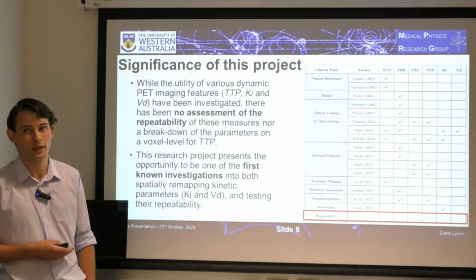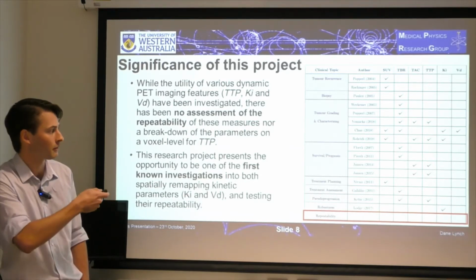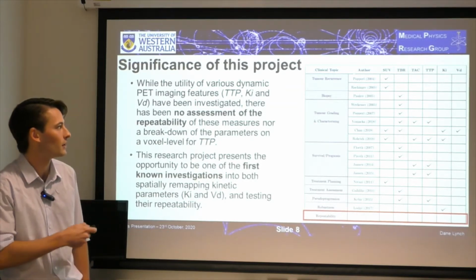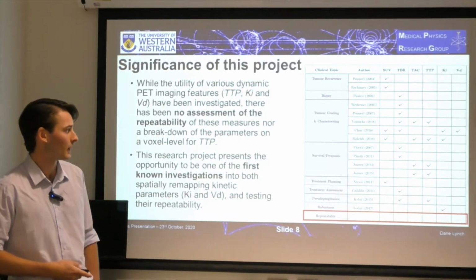and in testing their repeatability, filling this gap as shown by this literature review table on the right, where up here we have the types of PET imaging features and the clinical area for which they've been shown to be used and have utility.